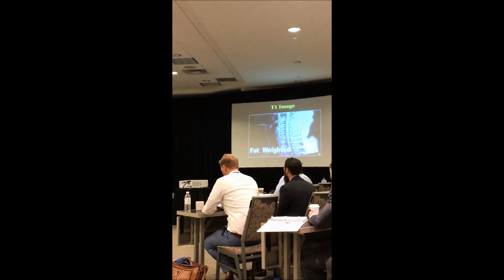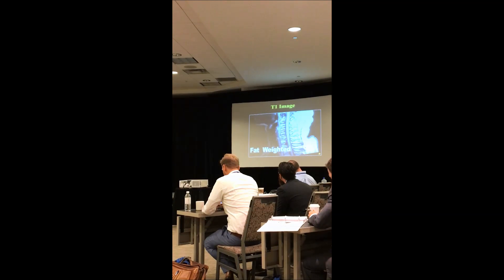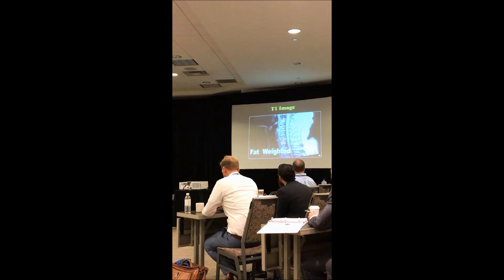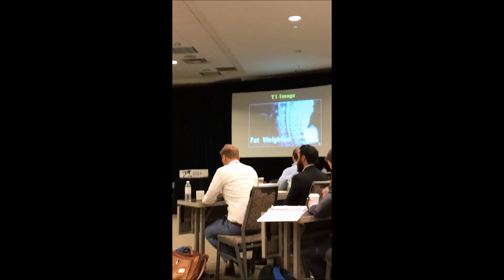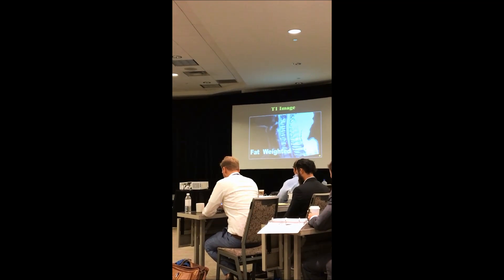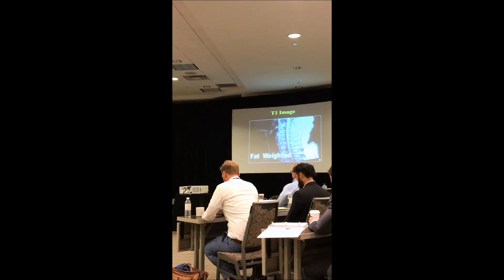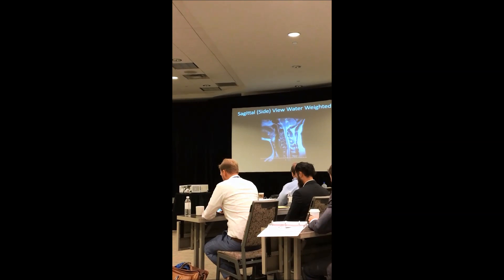On T1, if you look at this, this is anatomy. This patient had a hyperflexion injury — car crash, seat belt, forward and backward. You can see this vertebral body is normal, but this one's fractured. There's a fracture here at the inferior end plate and anterior end plate, with a disc herniation and posterior bony protrusion. There's a displacement along this fracture line and this part of the bone is extending into the canal, so you've got neurocompression on the cord — very well depicted on the T1 image.